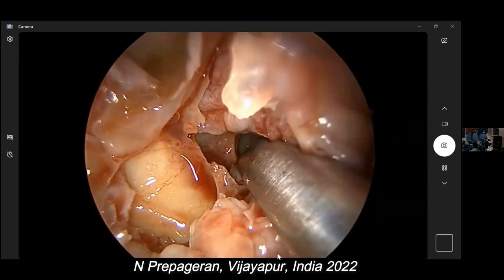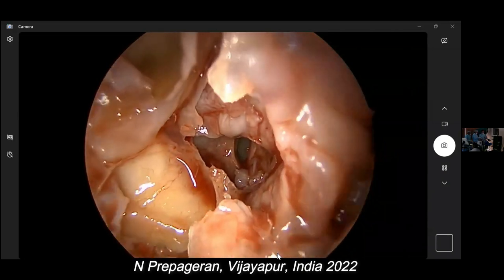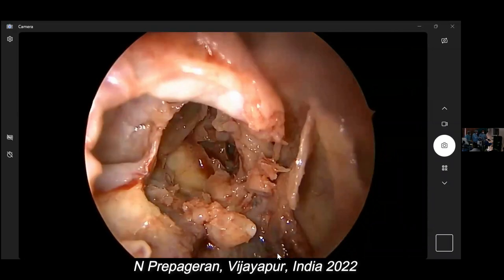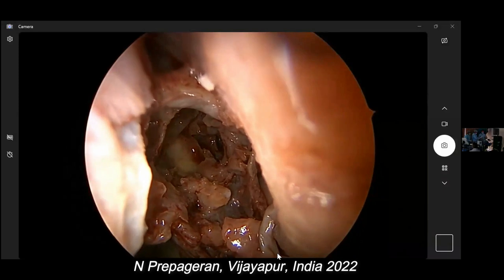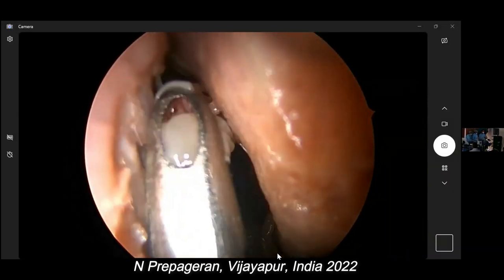There. I think we can see a little bit of bleeding. The feel of the tissue, it looks fresh. But I think we don't have to transfuse blood yet. So now, I'm going to remove the mucosa because, like I said, it's a cadaveric dissection.